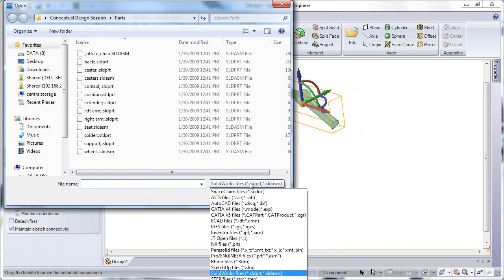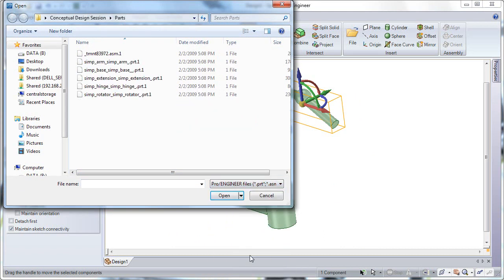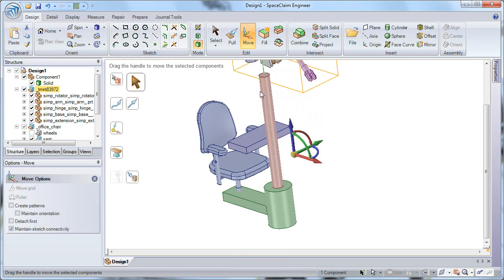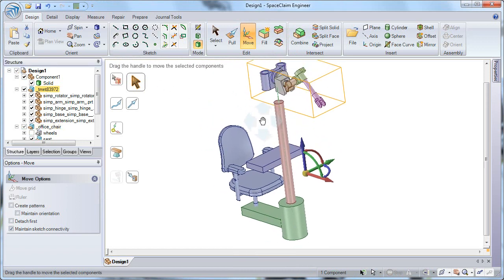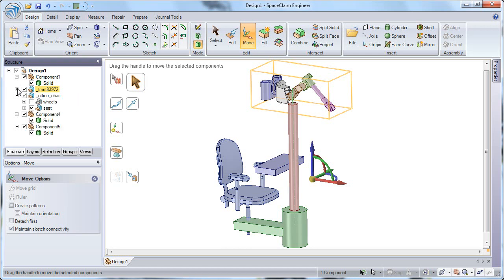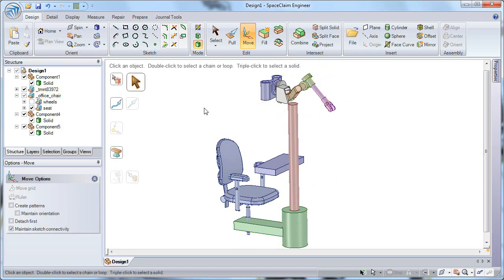Go to our file filter for Pro Engineer files. I'm going to choose that Pro Engineer file to bring in to replace that arm component. So you'll notice that the arm component comes into our assembly, again with the same structure that it was built in Pro Engineer. And it comes a little bit off of the assembly, so let's adjust our tower so that it's ready to fit in, so that the arm is ready to mount onto that tower.